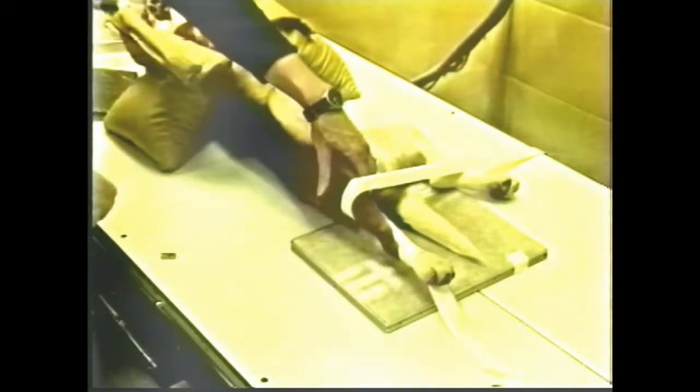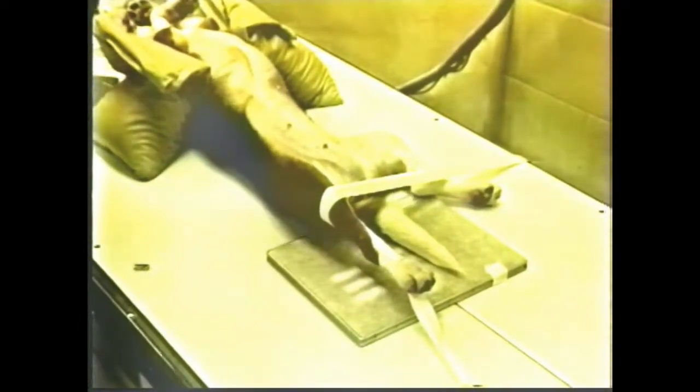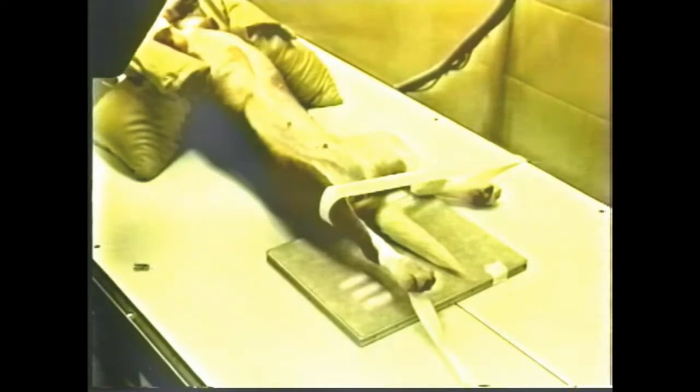The beam is then aligned over the tarsal area, remembering that we are on the opposite end of the cassette of the small tape which marked the previous exposure. The beam should be large enough to extend above the tarsus as well as down to the mid-metatarsal area.